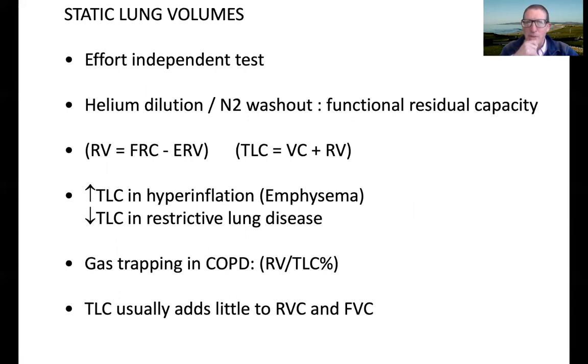Static lung volumes, you won't be examined on these. It's for information purposes only if you want to read up. So these are effort-independent tests. It's not a forced expiratory maneuver. They're measured using a marker gas, either helium or nitrogen. Tend to use nitrogen. This is known as the nitrogen washout test, which measures something called functional residual capacity.